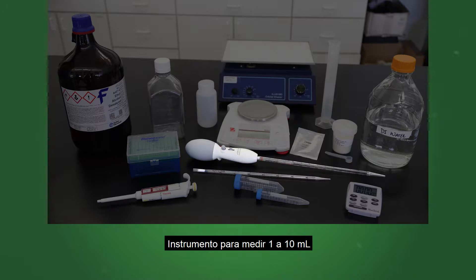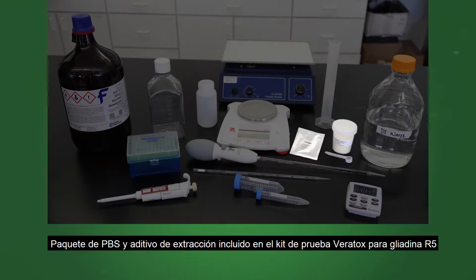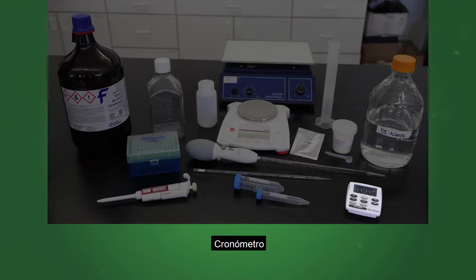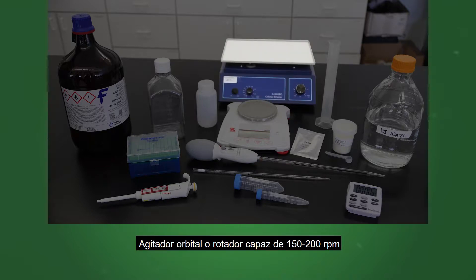You will also need a means to measure 1 to 10 milliliters, a PBS packet and extraction additive included in the Veratox Gliadin R5 test kit, a timer, an adjustable pipetter with tips, and an orbital shaker or rotator capable of 150 to 200 rpm.